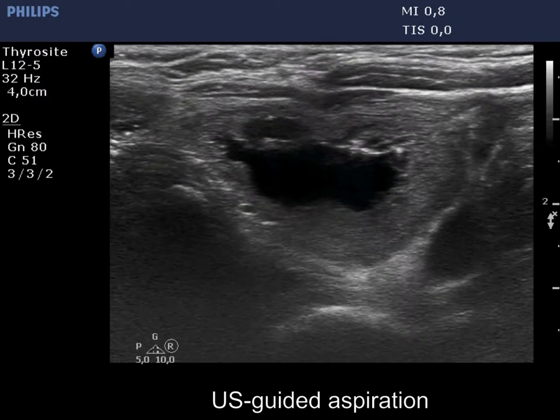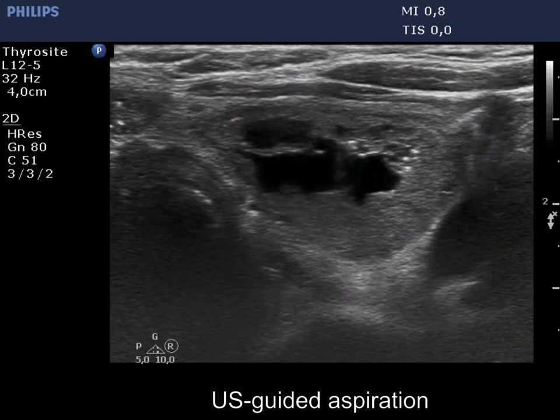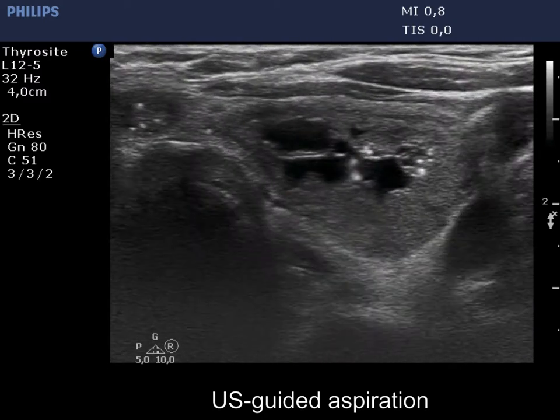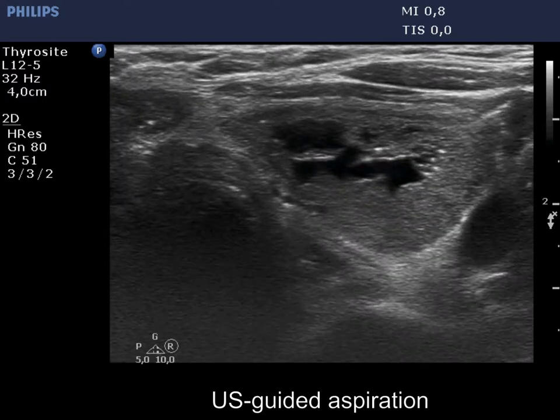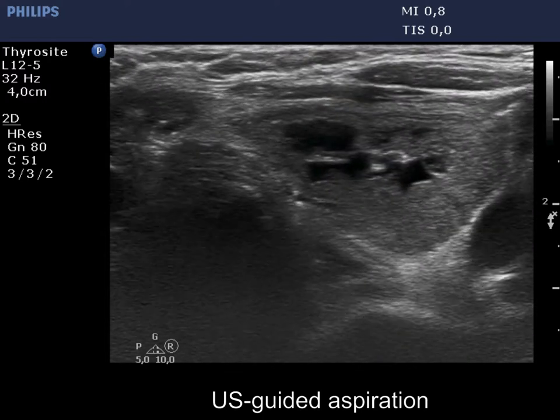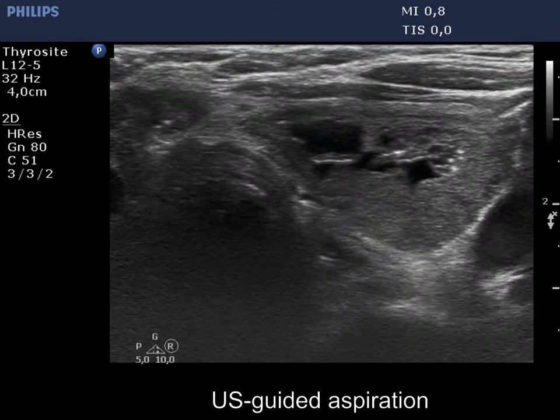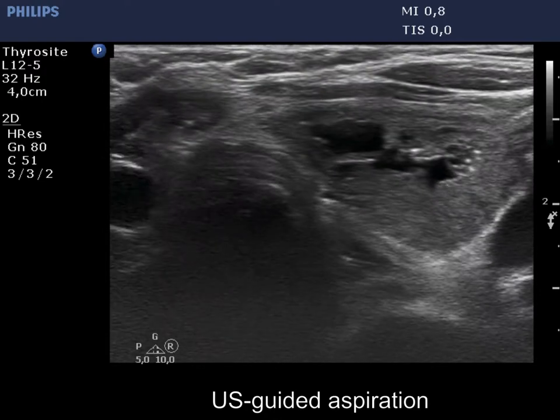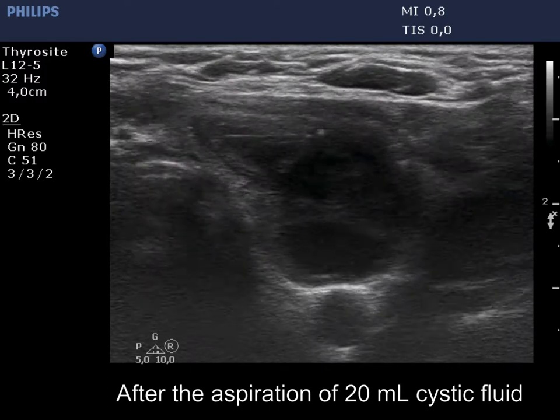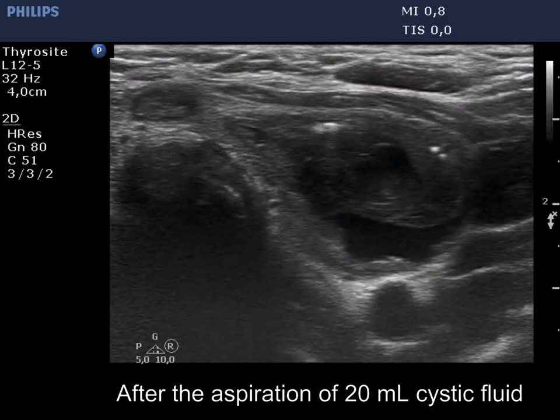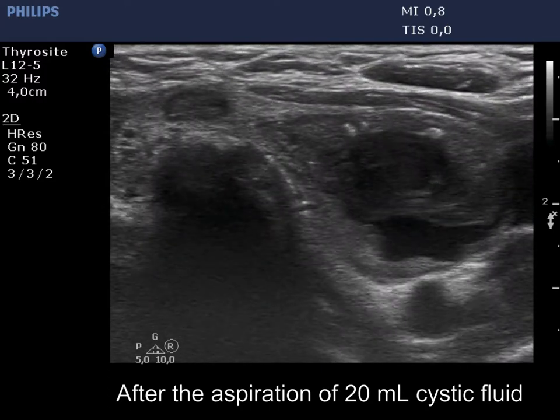Now, we locate the needle in the middle of the field of vision and start with the aspiration. The nodule is continuously decreasing in size. The needle has been removed.